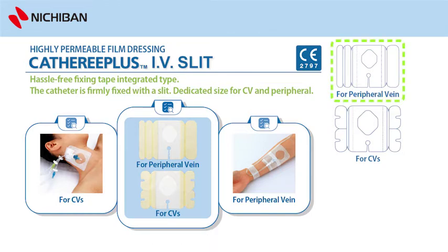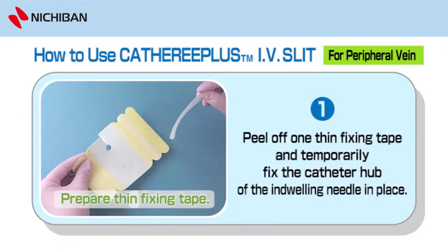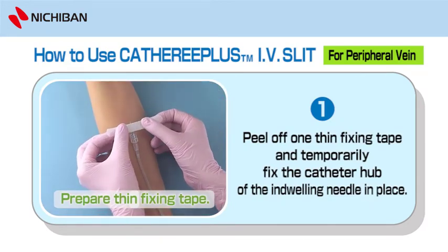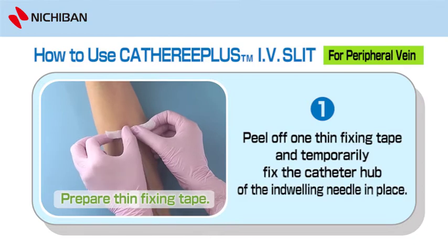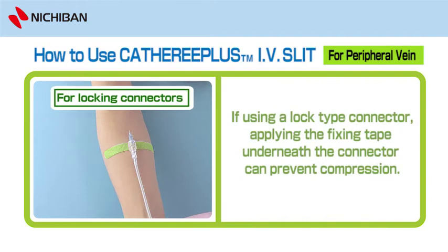To use Catharee Plus IV Slit for peripheral vein. Step 1: Prepare Thin Fixing Tape. Peel off one thin fixing tape and temporarily fix the catheter hub of the in-dwelling needle in place. If using a lock-type connector, applying the fixing tape underneath the connector can prevent compression.